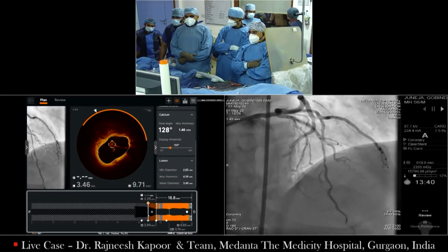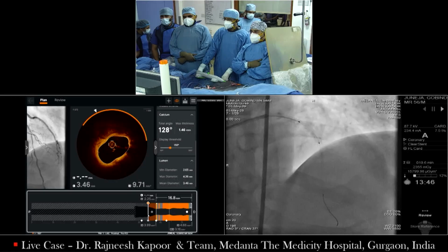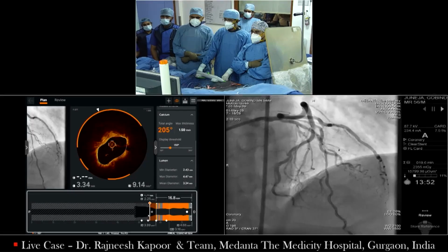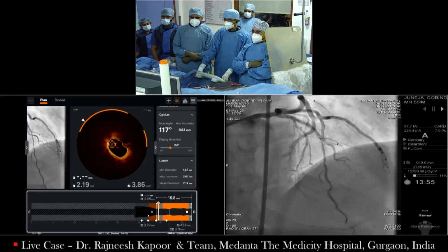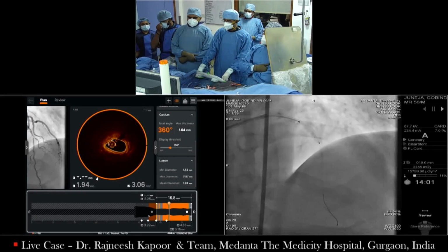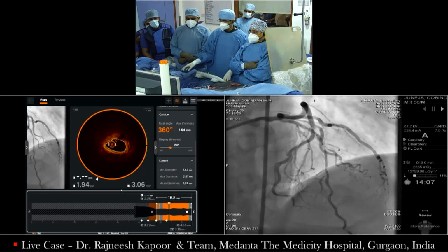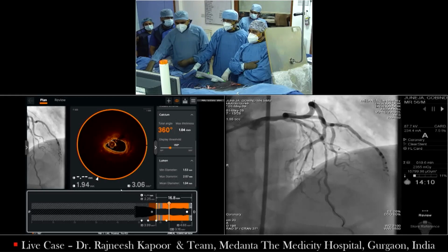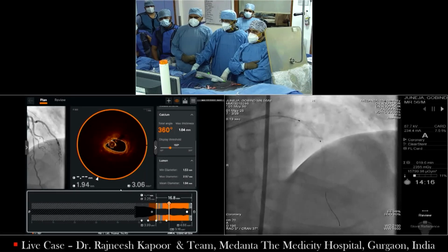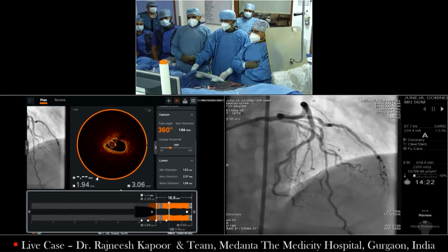So in an uncrossable lesion with really very severe calcification throughout the LAD, but also I'm afraid inside the left main, I think in my view, this is a case to prepare the lesion with rota, post-dilate, and then stent all the way into the left main. So maybe, of course, we can postpone that decision regarding the proximal landing zone, but before, I think we should, this is an uncrossable lesion at the level of bifurcation with rota, risk of occluding the diagonal is relatively low. So my strategy would be rota, post-dilatation, repeat OCT, and then stenting.